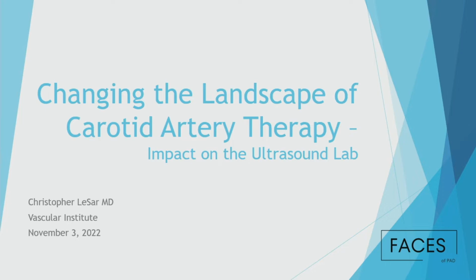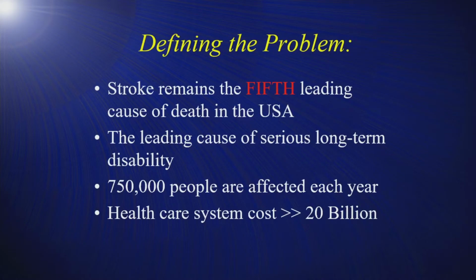We're trying to highlight some of the different technical changes and the different advances, and carotid surgery is also one of those areas where there's been some change in how we think about it, how we do it, and how we prevent stroke from happening. And then to see, is there really an impact on the ultrasound lab for you folks. So let's define the problem.